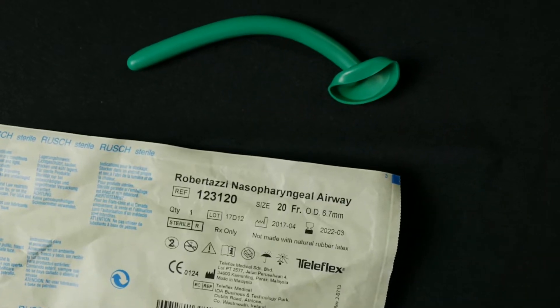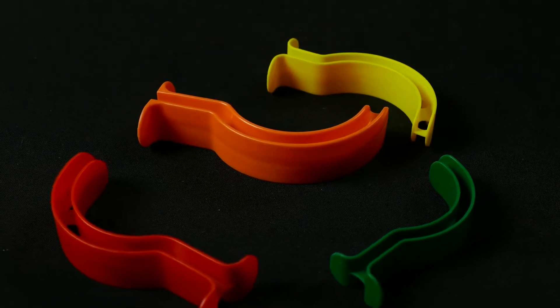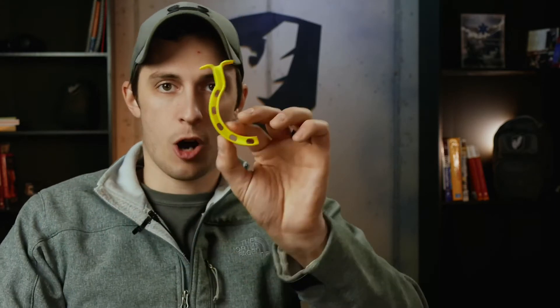Rather than manually holding the airway open the entire time, there are adjunct devices we can use. One is the NPA — nasopharyngeal airway. The other is the OPA — oropharyngeal airway. The OPA goes in the mouth and sits in the back of the throat; the tongue sits on top of it, but channels along the device allow air to pass by the tongue even if it's resting on top.